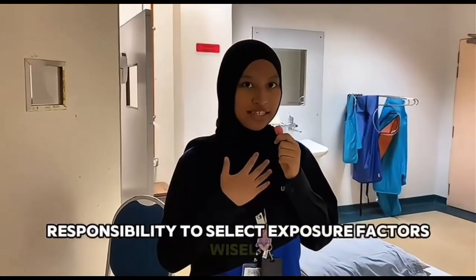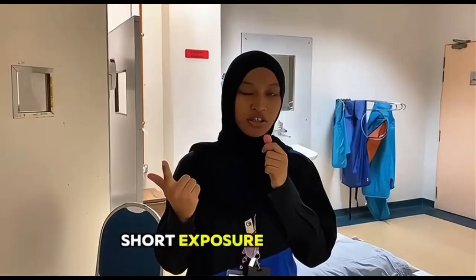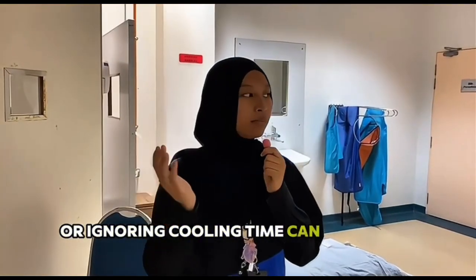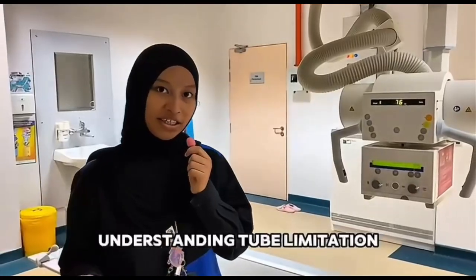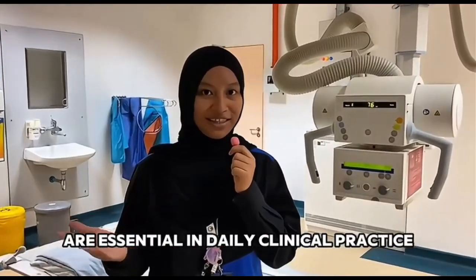As radiographers, it is our responsibility to select exposure factors wisely. Repeated high mAs exposure, short exposure intervals, or ignoring tube cooling can overload the X-ray tube. This is why proper technique selection and understanding tube limitations are essential in daily clinical practice.